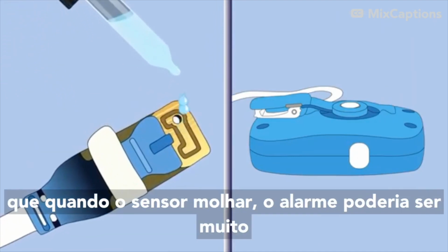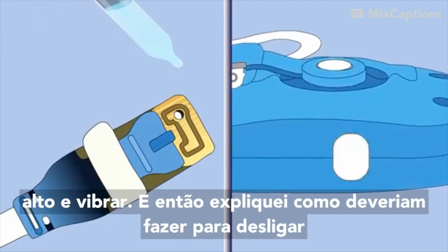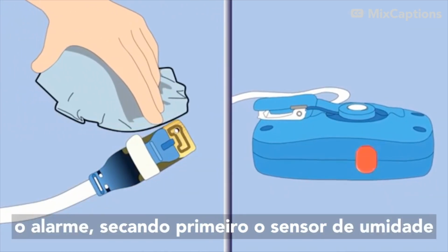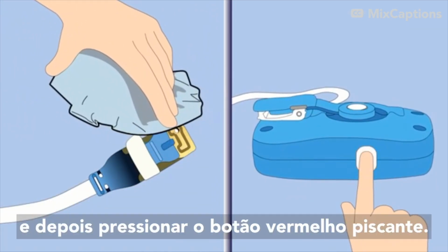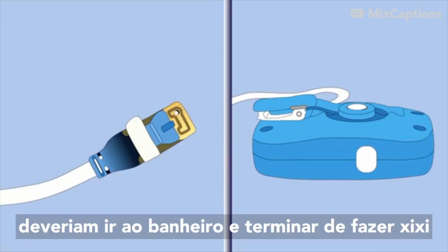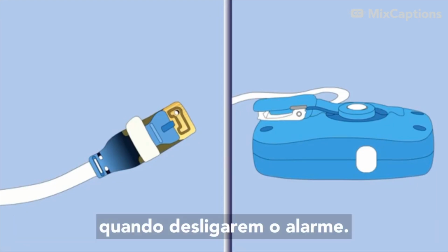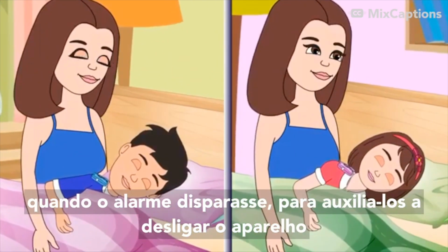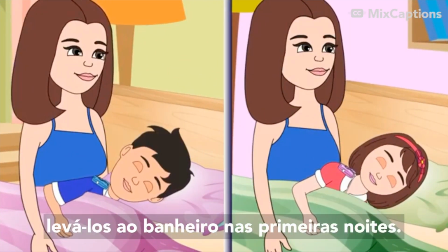I told my children how the bedwetting alarm works before our first night. I told them that when the sensor gets wet, the alarm will be very loud and vibrate. Then I explained how to turn off the alarm by first wiping the sensor dry and then pressing the flashing red button. But most importantly, I told them they still need to go to the bathroom and try to pee when the alarm goes off. I reminded them that I would be close by if the alarm goes off and I would help them turn it off and go to the bathroom.